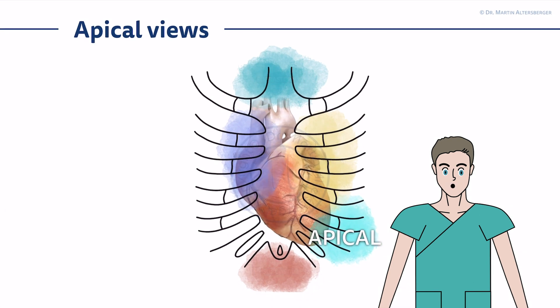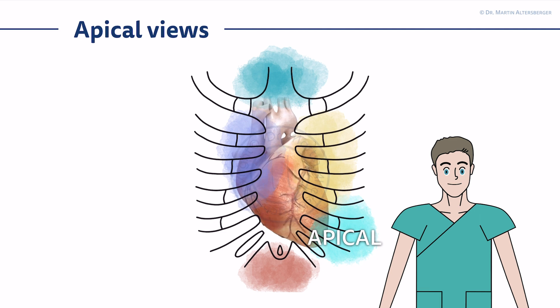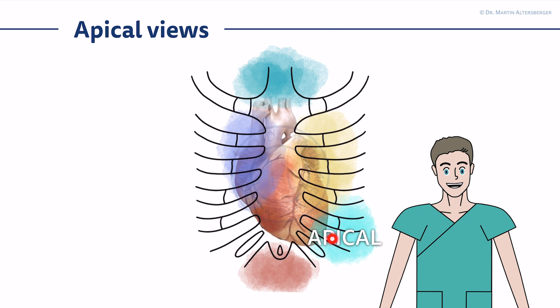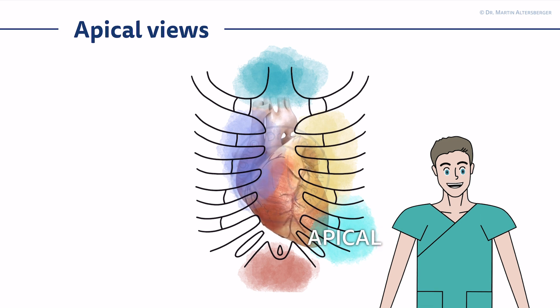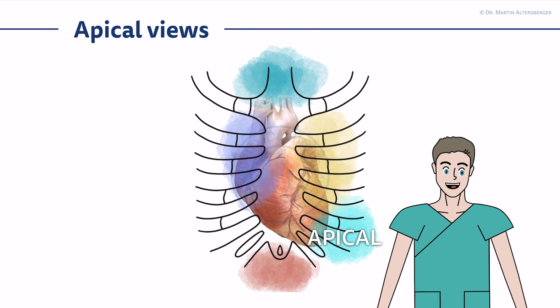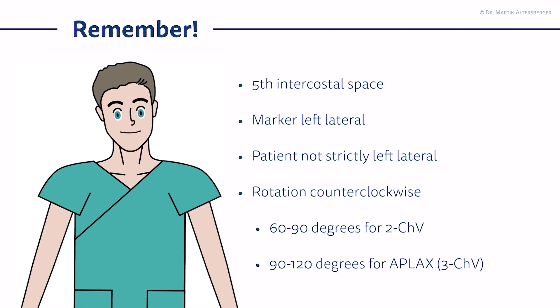How to achieve the views? You stay at the apical parts of the left ventricle. This is a highly variable view. You start with the four-chamber view, the marker pointing towards the left side of the patient. The patient is not entirely left lateral, and then you start with a rotational movement counterclockwise, always keeping the structures you want to see in your field of view.